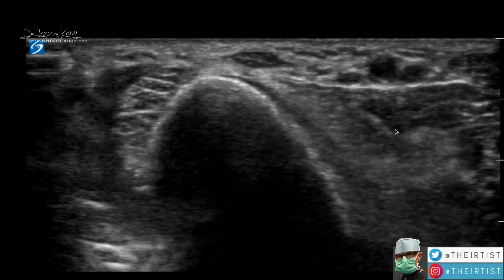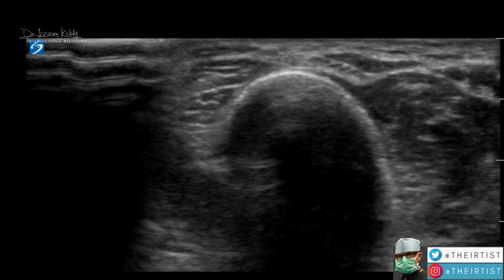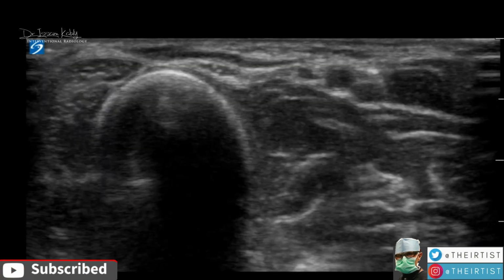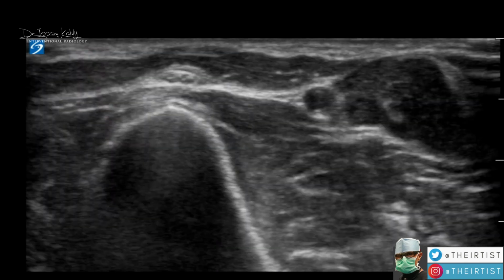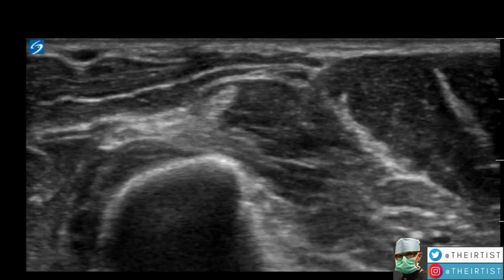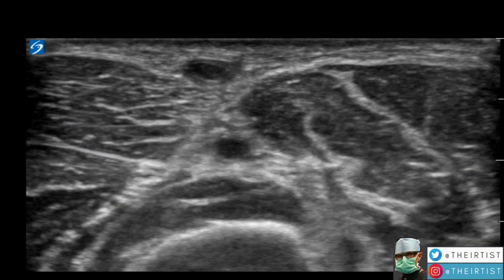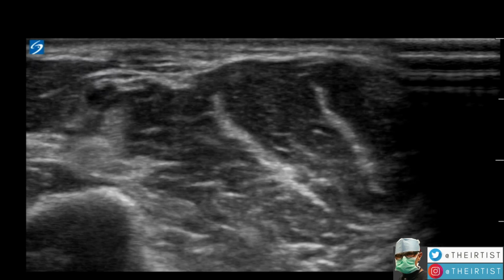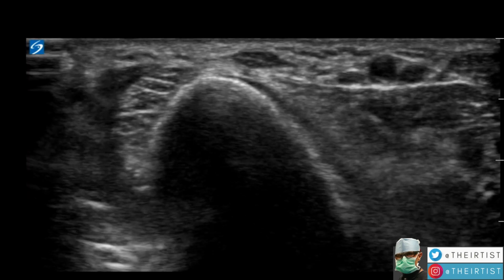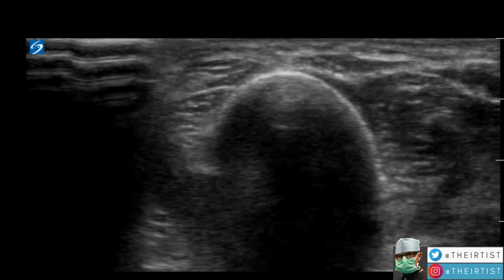So the risk benefit for the patient is favorable, and also the majority of patients prefer the radial access. My patient asked me which is better, radial versus femoral. Patient satisfaction surveys clearly indicate that most patients are in favor of the radial access, especially those who have undergone both procedures.